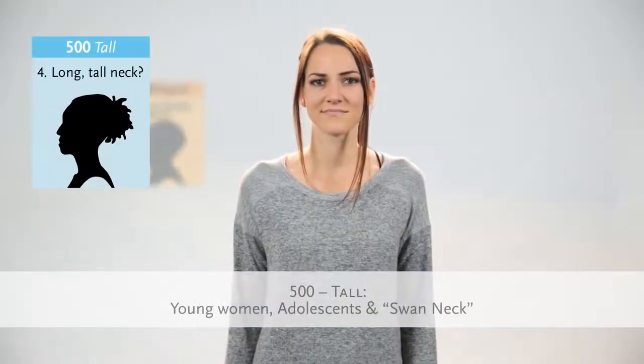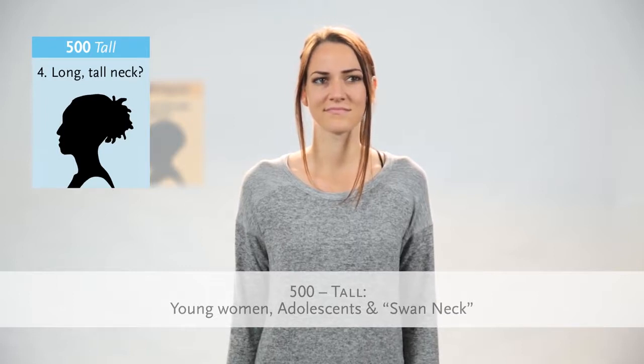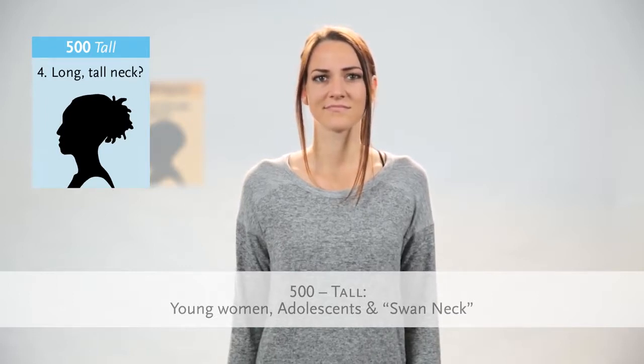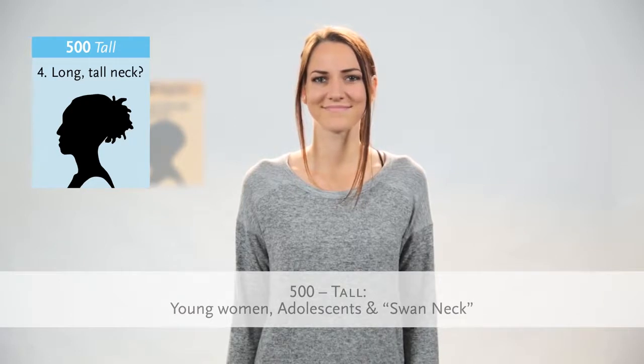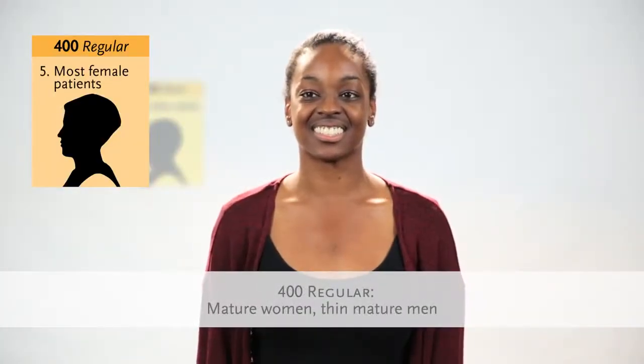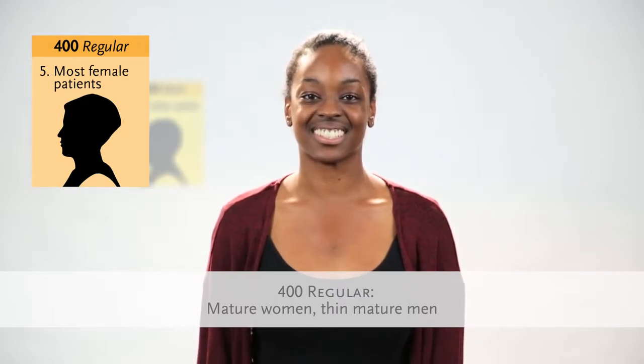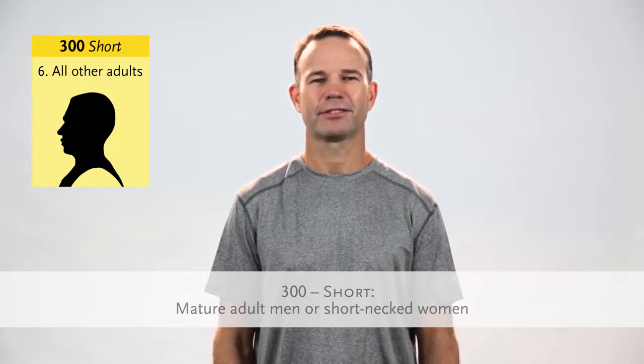Does your patient have a long, tall neck? Consider using the Miami J tall collar, common for young women and adolescents, and those referred to as swan neck. Is your patient female? Consider using the Miami J regular collar, the standard size for mature women or thin, mature men. Consider using the short collar for all other adults that do not need a specialty size — the standard size for mature adult men or short-necked women.